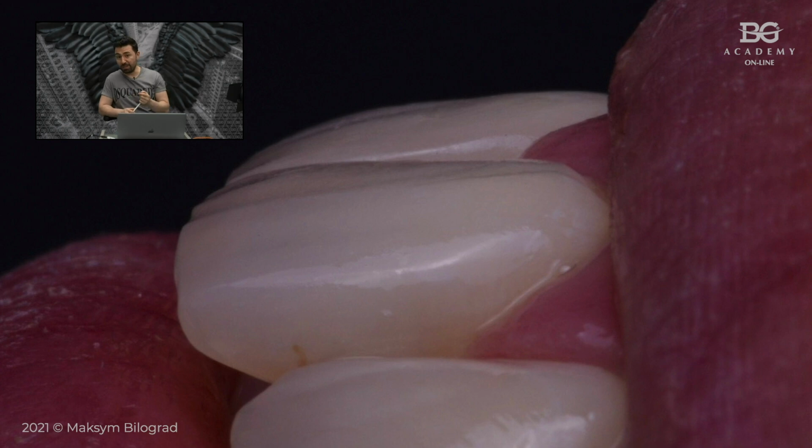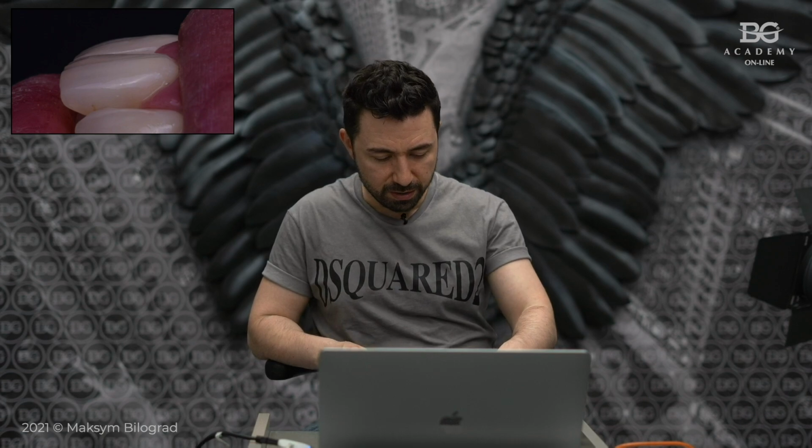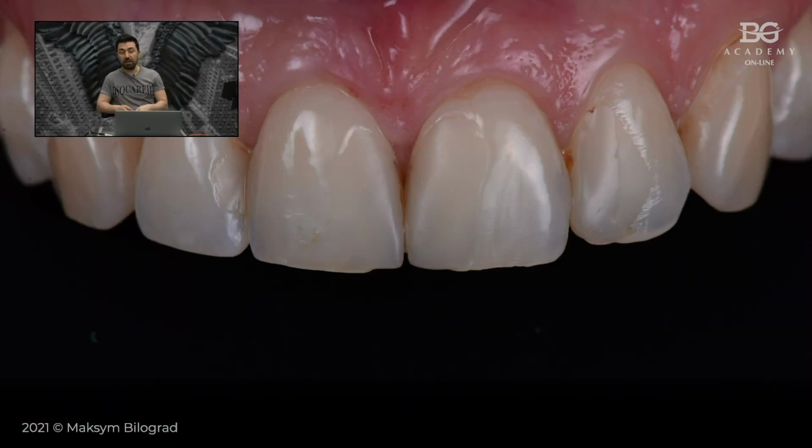And as I promised you at the very beginning, now I will give you an answer what happened with the teeth of our patient before we actually started replacement of the new restoration. So again, this is initial. You can see the difference between enamel and artificial part, between enamel and her previous restorations. That step is visible, and we have to understand why it happened and how to avoid this in the future.